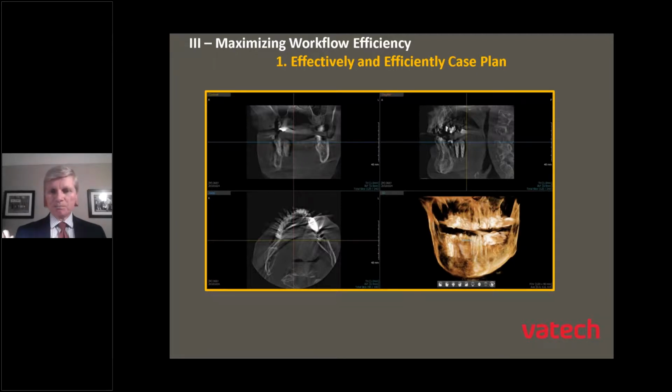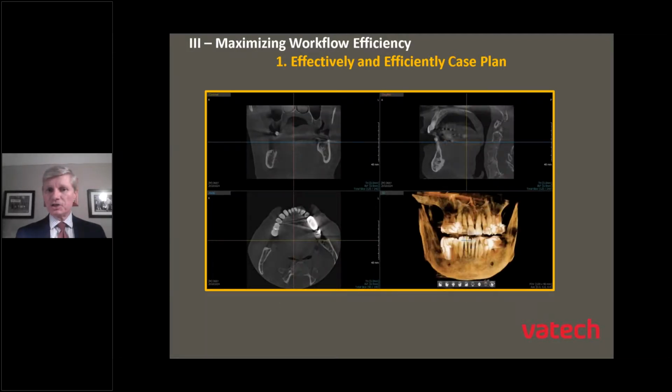So to avoid bringing the patient back in after you've taken the scan and looked at it at the end of the day, I strongly recommend you spend just 1 or 2 minutes, open the CBCT scan and evaluate it for those 2 points. Verify you captured the intended region that you're looking to evaluate and treatment plan, and also make sure it's a diagnostic image. In this case, the doctor was good enough to look at the scan before discharging the patient, realized the scan was not usable, and took another CBCT scan.